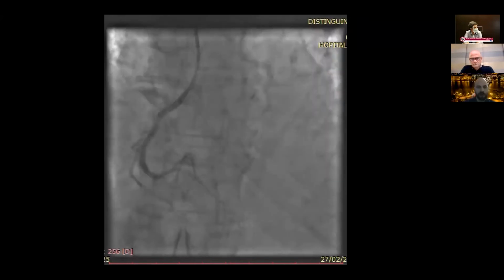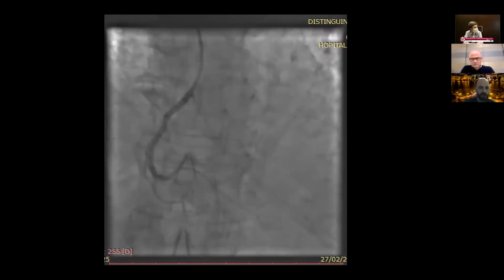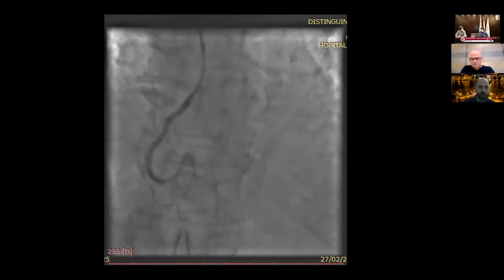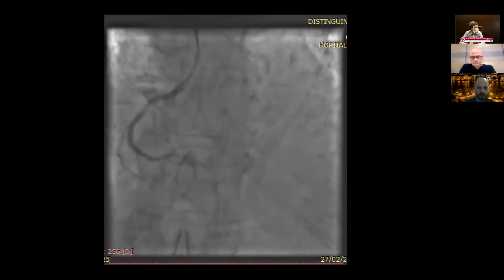Luckily, at my cath lab, we have peripheral ECMO available 24/7. This patient, on the other hand, was not really eligible for mechanical circulatory support because of the aortic disease that he had. I think I would also have inserted a balloon pump in this case and done it very, very similarly. So again, congratulations on your case and saving this patient, because this was a young man. Thank you.